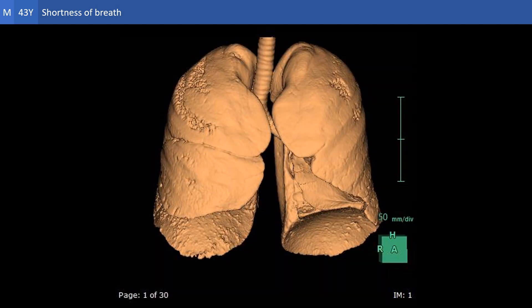The fourth and most specific feature of this disease is the presence of parallel bands of pleuro-pulmonary involvement at the anterolateral surface of the upper lobes, separated by uninvolved lung surface. In fact, we are dealing here with a case of systemic sclerosis, or scleroderma.